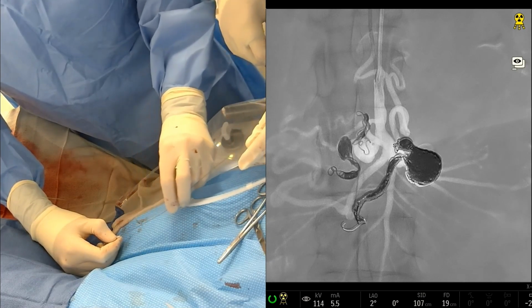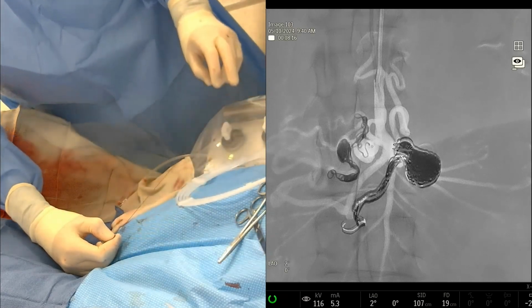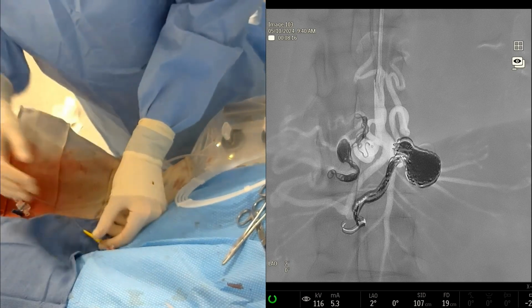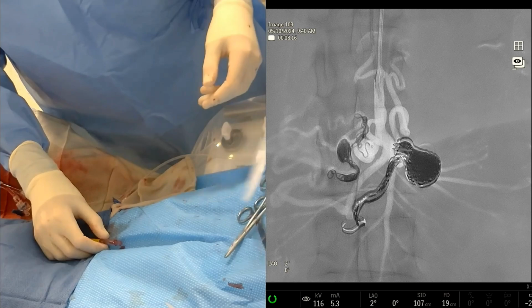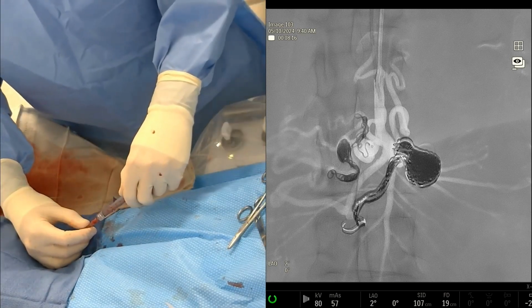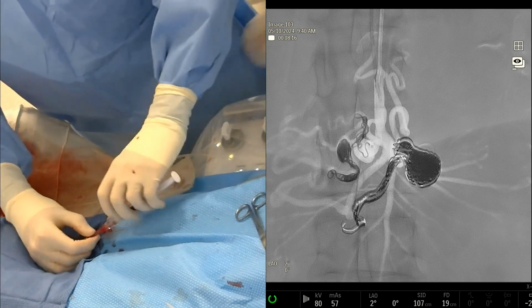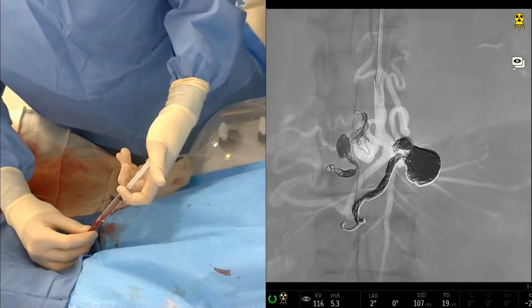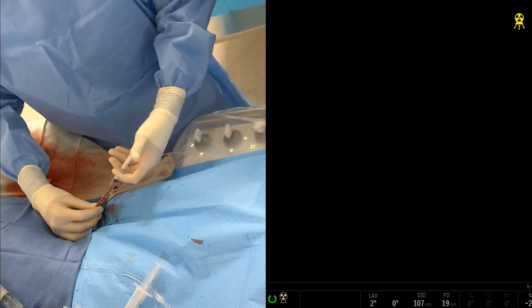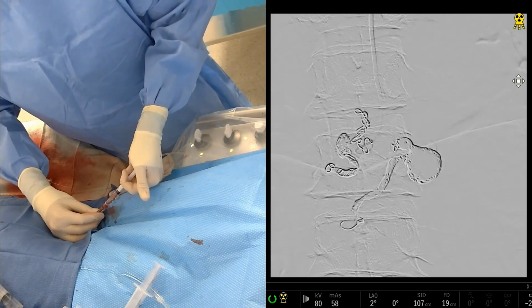Okay. So I think now we've got to figure out where we are exactly before we start putting more coils in. I think you flopped into the first aneurysm. You're in a big aneurysm, but let's just get back into it, just at the origin of it. Maybe get back in a little bit. Now you're happy you have that high flow already. So we have the high flow. You can see the pulsation. Just do a run here. Oh, actually, you're looped on yourself.